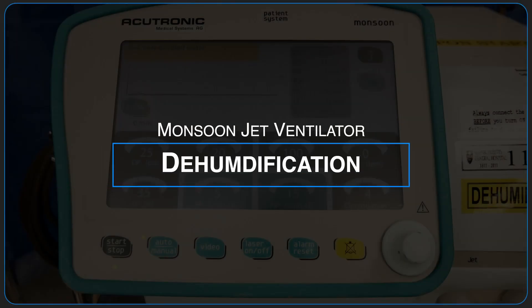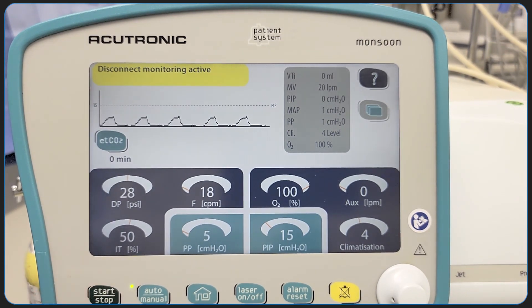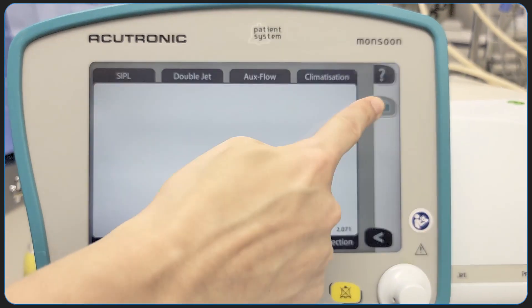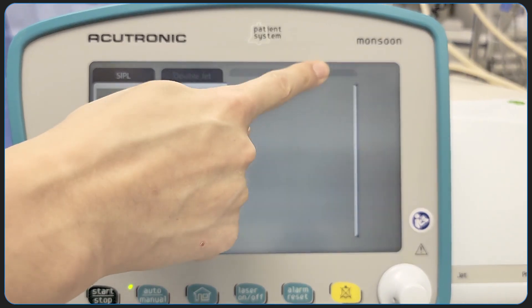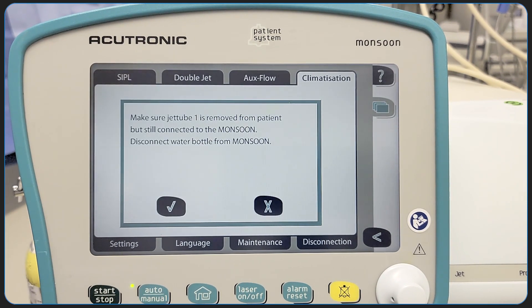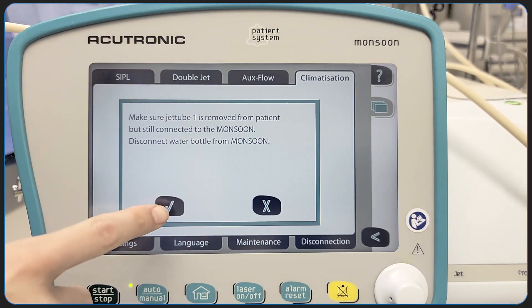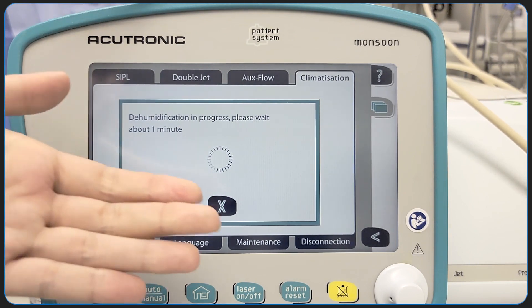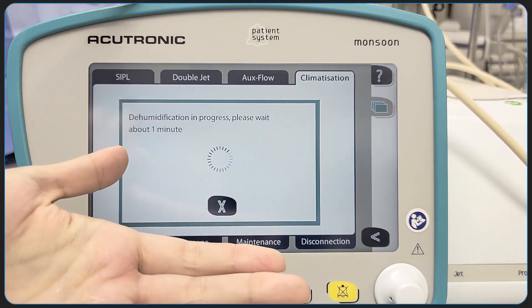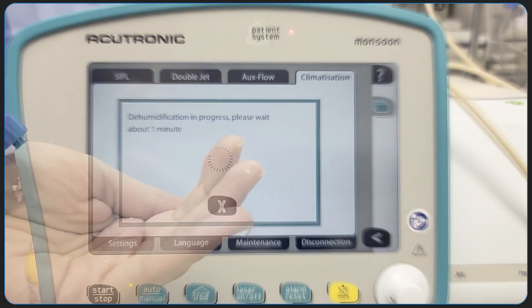After completion of jet ventilation, the apparatus must be dehumidified to prevent buildup of stagnant fluid and potential bacteria. To do so, press the start-stop button to stop the machine. Now press the stack menu, followed by climatization and then dehumidification. You will see a reminder message to disconnect the tubing from the patient and to disconnect the sterile water tubing from the machine. Proceed with those actions and then press the check mark. Here we demonstrate fluid being ejected from the ventilator during the dehumidification process. Allow the machine to finish dehumidification and then press the check mark.